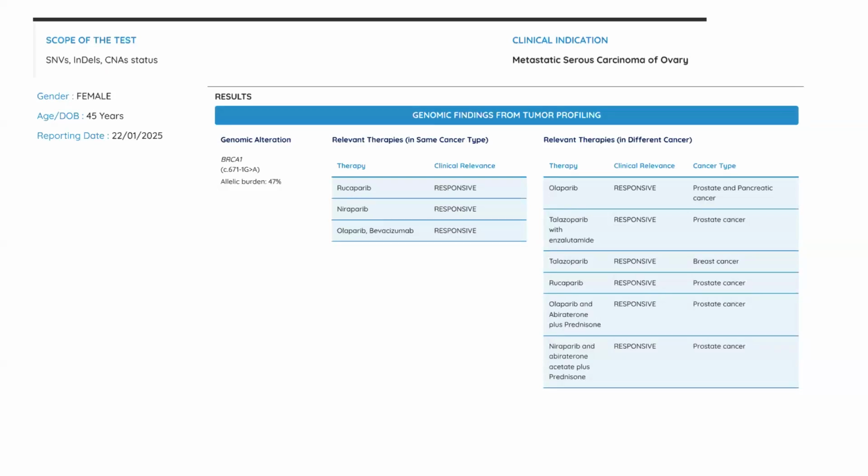This is another case. Here it is a very different type of mutation, called a splice mutation. Splice mutations are not present within the complete exon; they are present at the exon-intron boundaries. Introns are non-coding regions, right? A classical canonical splice variant is observed within 2 bases, plus or minus 2, of the exon-intron boundary.